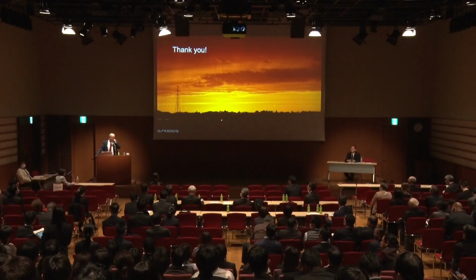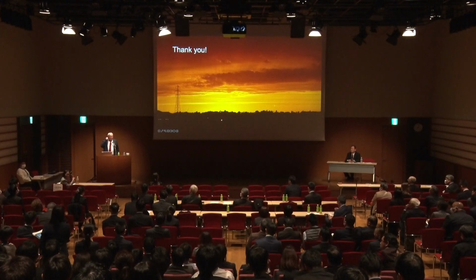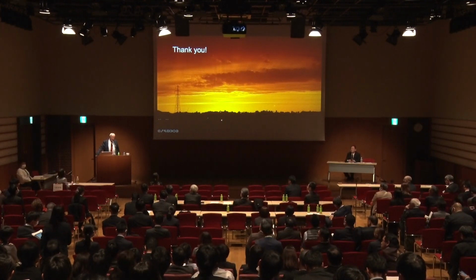Does it, for example, in the future, maybe it can detect the exact site, or do we have to add more information? So I don't think so, because the movement of the horse's leg, with a few exceptions, does not indicate the site of the lameness.